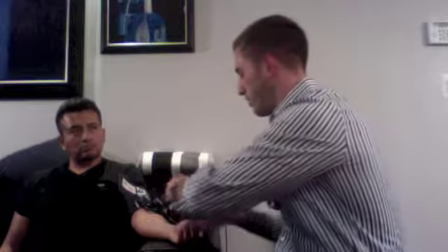I'm listening with my stethoscope on his brachial artery, and when I hear the first sound, I'll make note of that sound and where I saw it, which is the systolic pressure, and that's when the artery is opening, and that's when the blood is first rushing through. And at the end, when I no longer hear a heart sound, that is the diastolic pressure, and that is when the vein and artery is completely open. So we'll go ahead and do this.